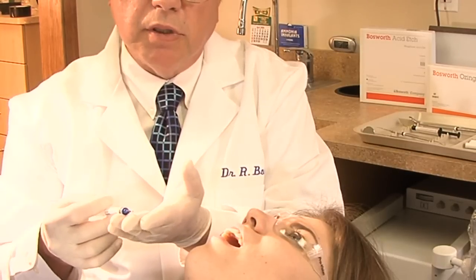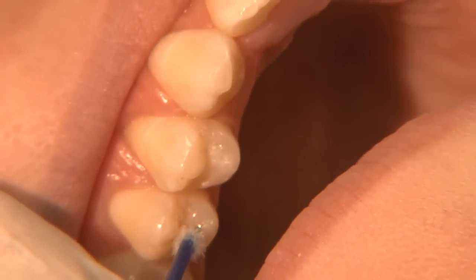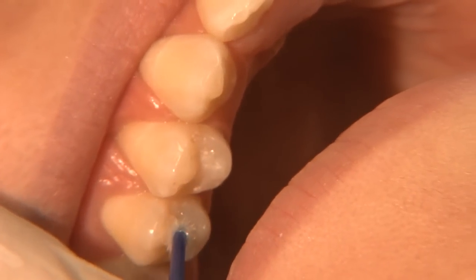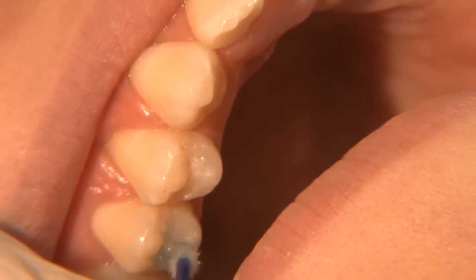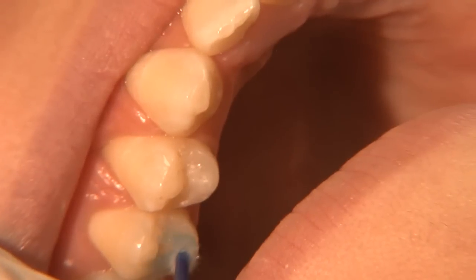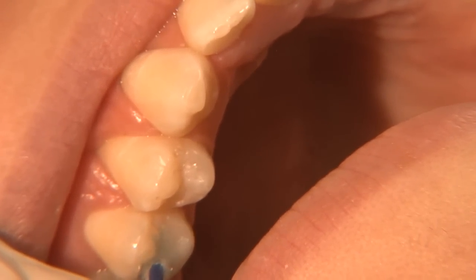The Bosworth acid etch applicator is very unique — it has a bristle at the end. It is not very flowable; it's a little more viscous, so that you can place it on the bristles and then paint it right on the tooth where you want it. This way it does not flow everywhere. By dabbing it as I'm doing, it allows it to go into the deepest crevice of the pits and fissures of the tooth to etch it totally.